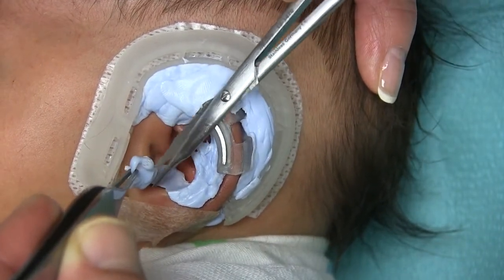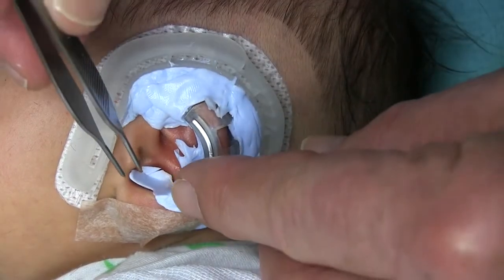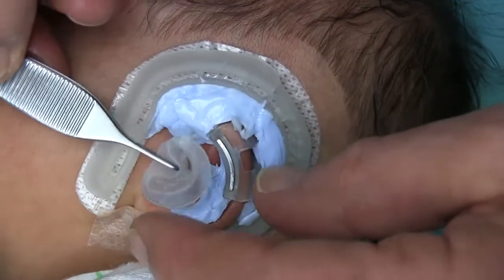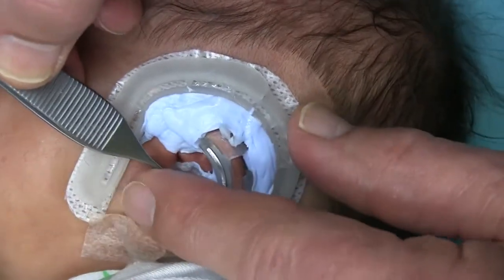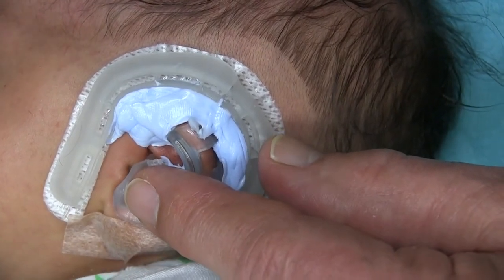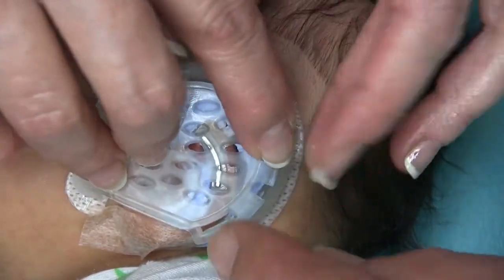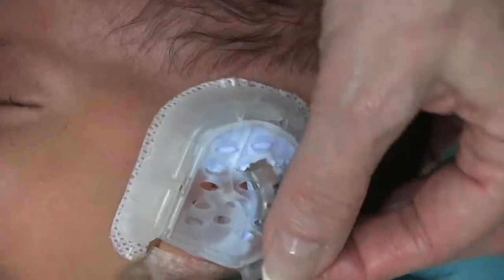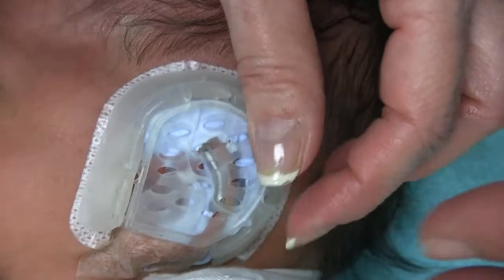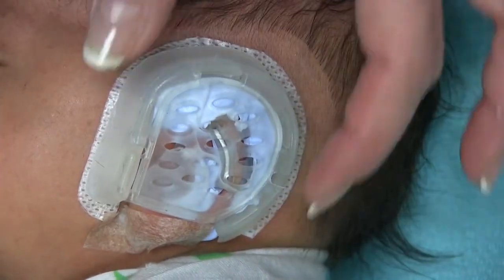Making sure he's not going to jerk. Okay. I got it. Let's snip off. We're still okay with that. We're almost done. All right, just leave it. Pretty good. Okay. Did I get there? Find the right spot? Looks like it. Okay, I think it's over. Good.